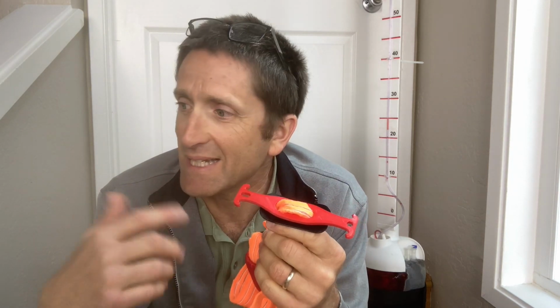Again, just a little bit more summary about the testing that we just did. I know it seems a little bit crazy for me to be going down this path. My wife says to me, "We sell a pressure wrap. What are you doing? And you don't even like tourniquets. So what's happening here?" Some of the backstory, I love direct pressure first. I like wrap to the point of arterial occlusion only if needed. I have added some 3D printed windlass designs, and I'm just experimenting right now.